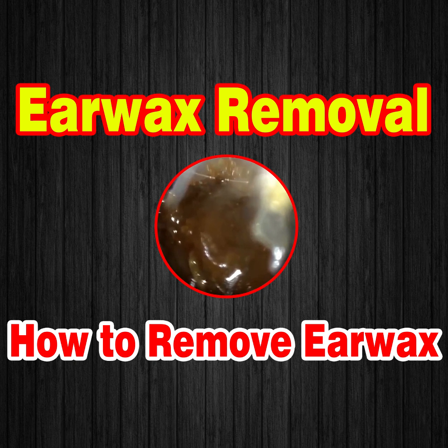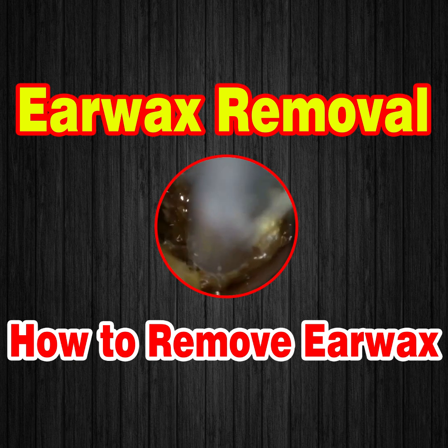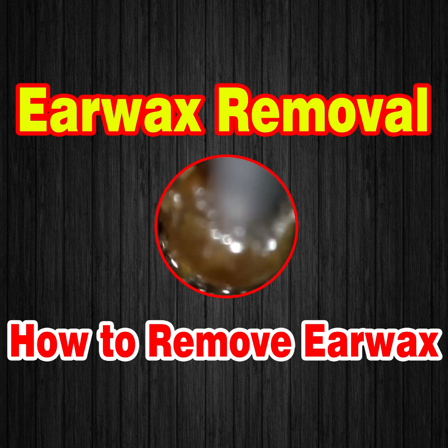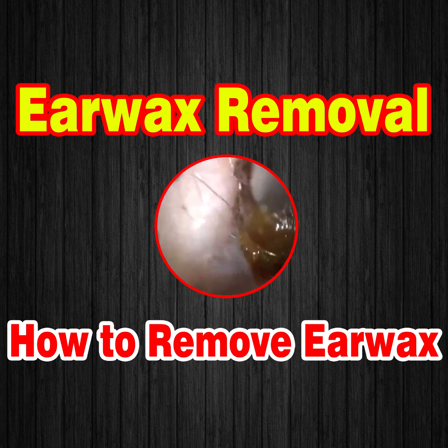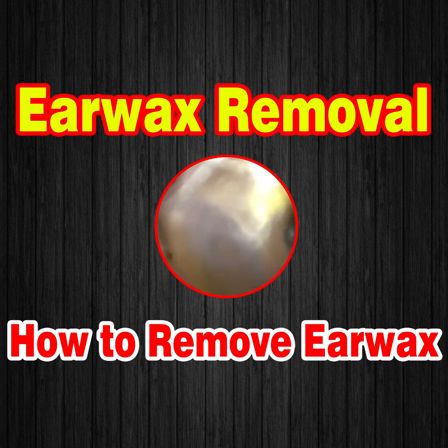I decided to use the 4.25 mm speculum, but could have quite easily used the smaller ones, but I was able to dilate the ear canal with this. It wasn't too big, so it just gave me a bit of a better visual. And you can see that last plug is extremely dark. Now here you'll get a perspective of how narrow and bendy the patient's ear canal is.